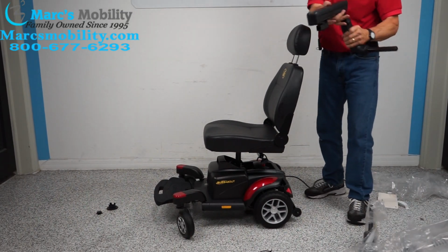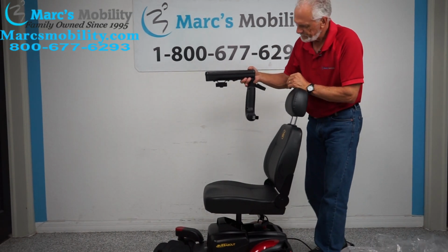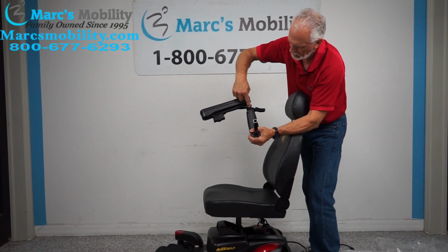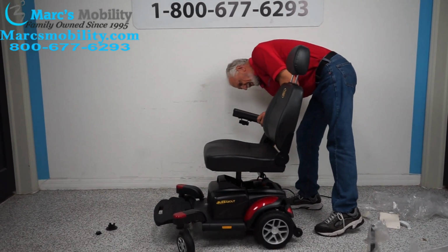So this is the right arm. It has the dock. It has this right here for the joystick. So if you're going to put the joystick on the left side, just take the top part of the arm right here, this top part off, and put it on this side, okay? So I'm going to put it on the right side.